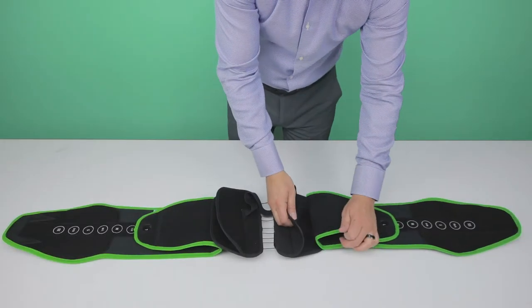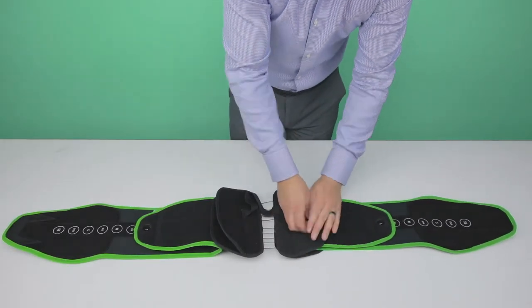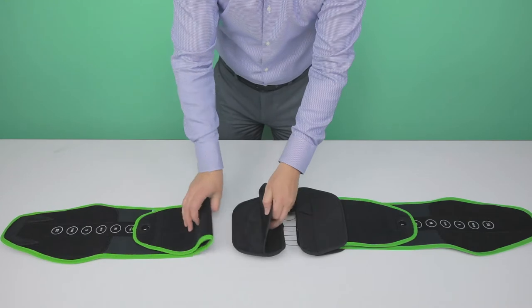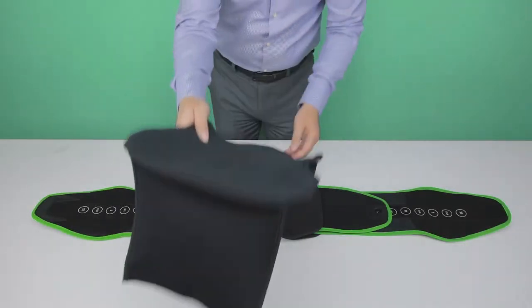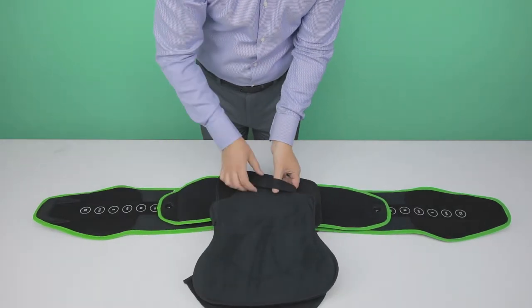Insert and center both soft panels into the center clamp and press down firmly. Insert the central rigid posterior panel back into the elastic band.